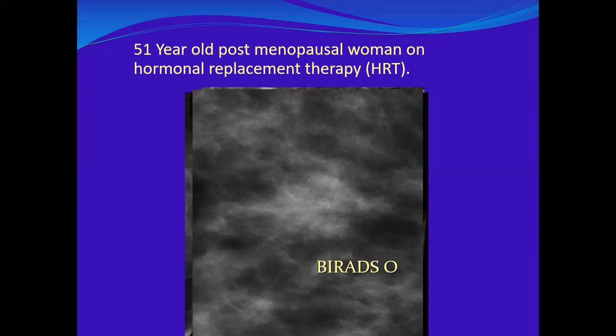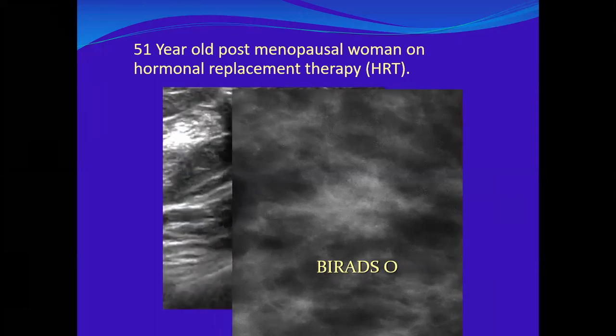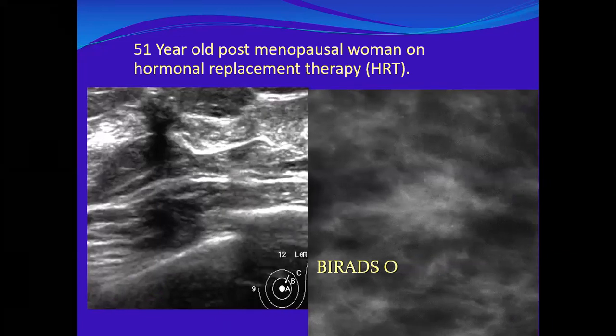Focal fibrocystic change, once she is on hormonal therapy. Excellent. Hormonal therapy. Yes. What else? Stromal fibrosis can also be. Okay. That is the ultrasound. So that was the ultrasound, with the upgrade in the ultrasound.